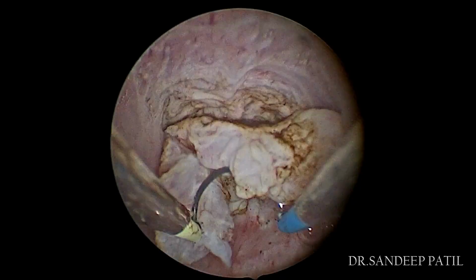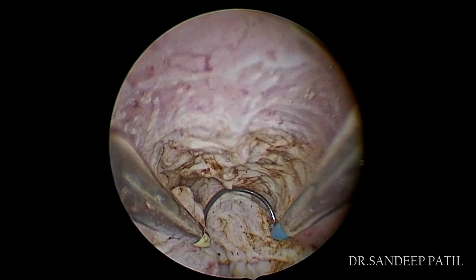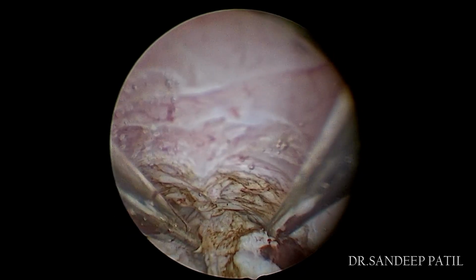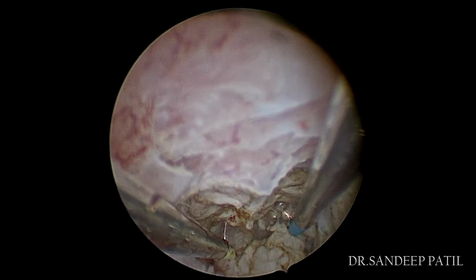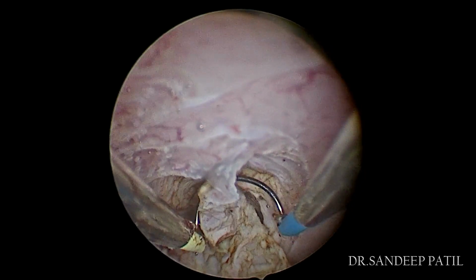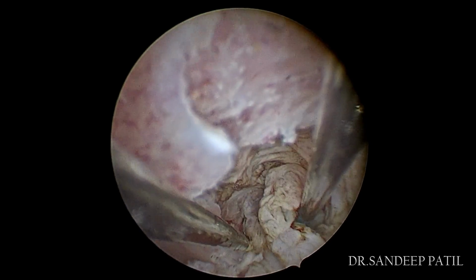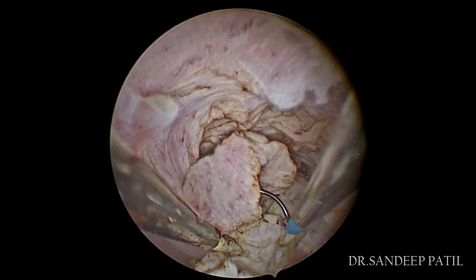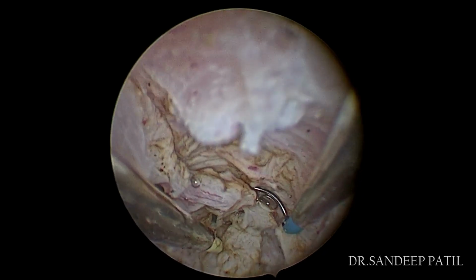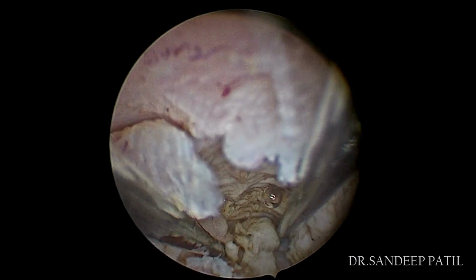Once we locate the fibroid, the next step is endometrial incision over the fibroid. A vertical incision is made on the overlying endometrium using a bipolar cutting loop to expose the fibroid capsule. The fibroid is gently dissected by slicing in small controlled chips. Intracapsular mobilization by cold loop is also done for bigger fibroids, which helps us to save time. This technique helps to displace the fibroid further into the cavity, making resection easier.